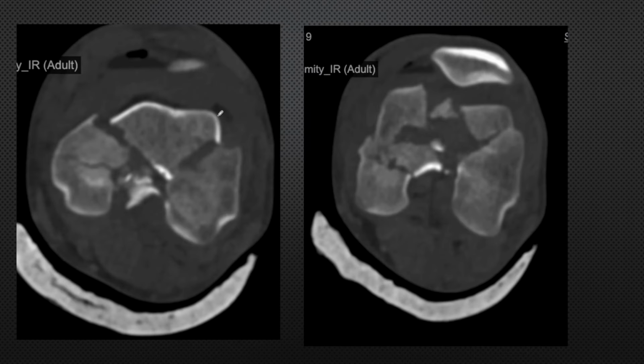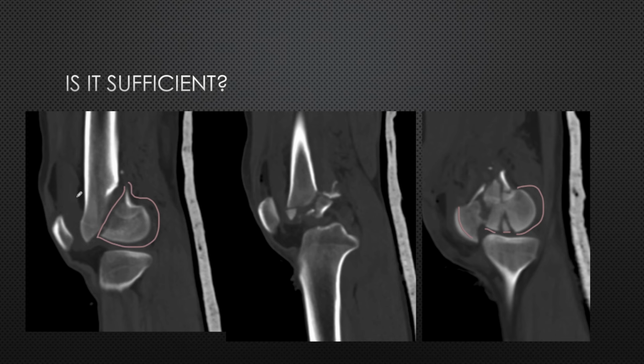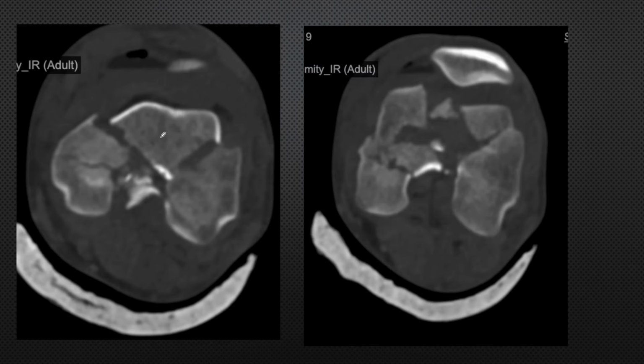Again the same picture. We see a large fragment of the trochlea which was actually continuous with the proximal segment because it is a low fracture. Here you see this fragment is continuous with the proximal fragment, so it is not fractured. In the axial cut we are able to see it because it is separated from the remaining part of the condyles.